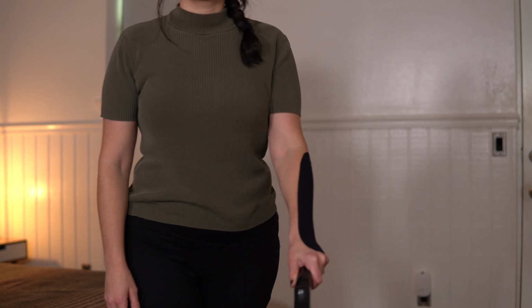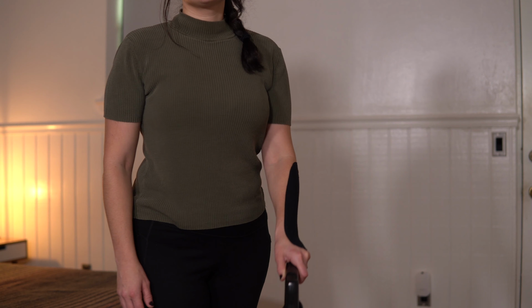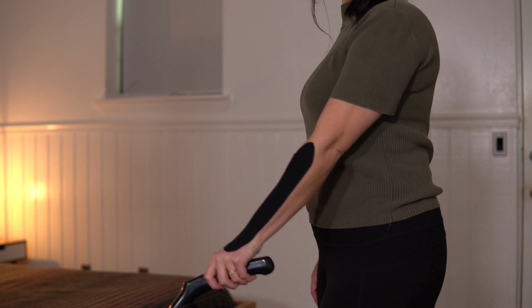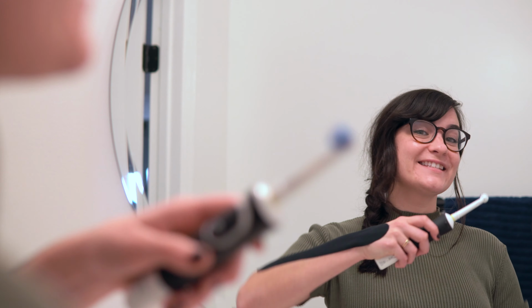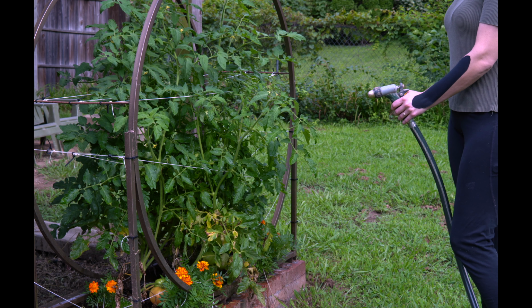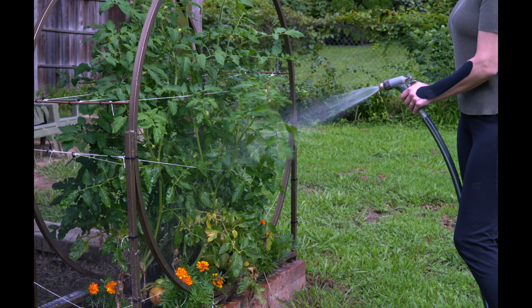You can also work on household activities like vacuuming, wiping down counters, washing the dishes, putting the dishes away. The more that you can engage in everyday functional activities, the more you're going to also help to work on neuroplasticity. I'm showing you here, you can use the K-tape while you're brushing your teeth. Requires some degree of wrist extension to brush your teeth successfully. Use Kinesio tape to do things that you enjoy too. I have a small garden and I really enjoy it.